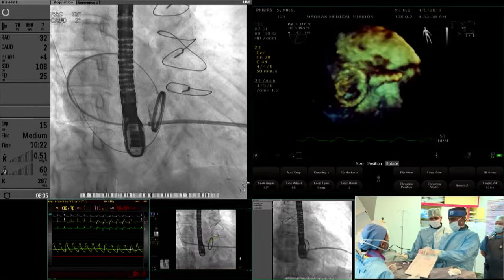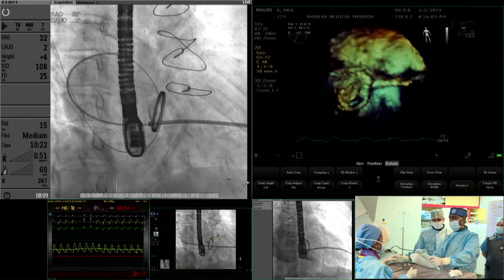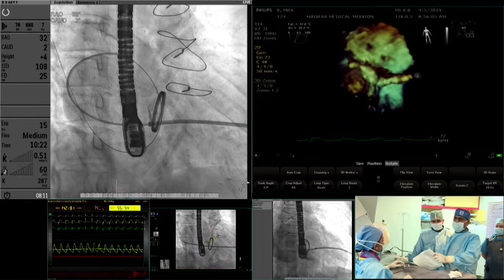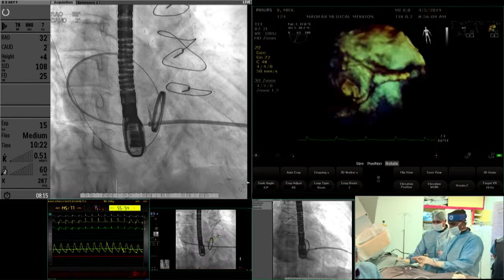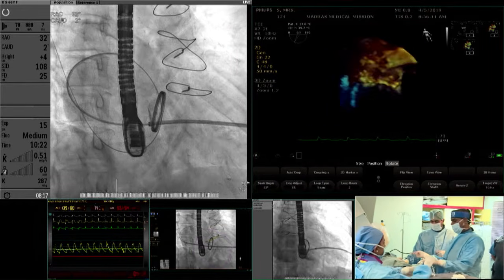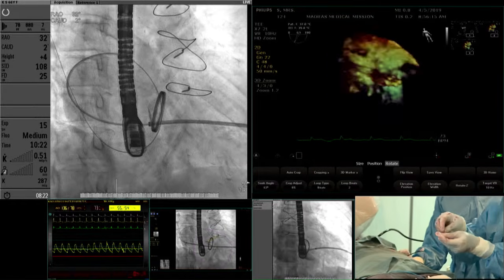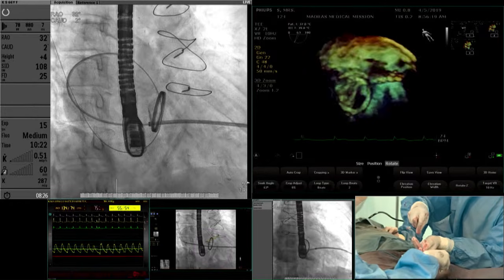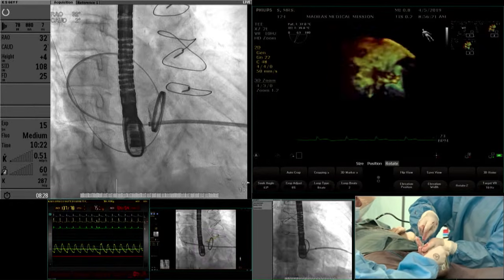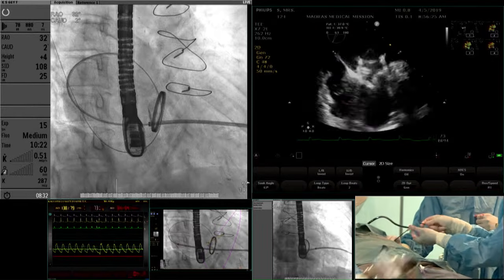So when do you give heparin? In this particular patient, I put the timer on, and if I am able to complete in 15 minutes, then I don't give heparin. Right now I am running at the 10th minute. And how much heparin do you give? I give 5,000 units, but right now I have not given any so far. I'm going to wait till 15 minutes, and on a regular working day we will be able to complete it. Now this is live, and so we are spending a little longer.